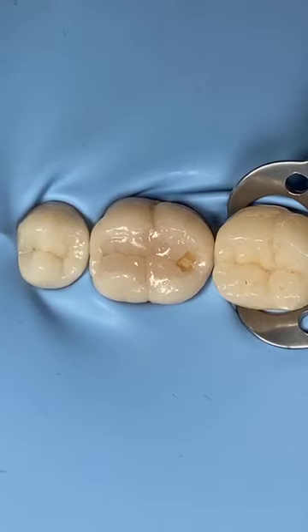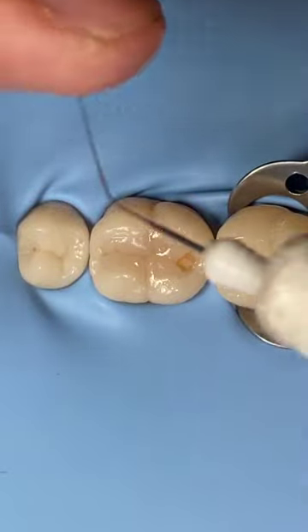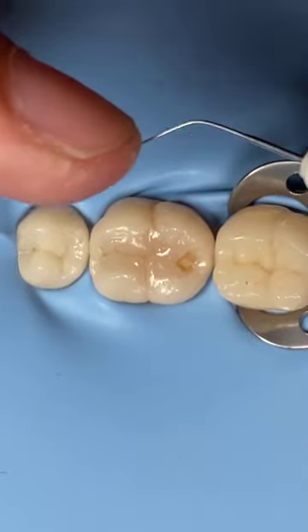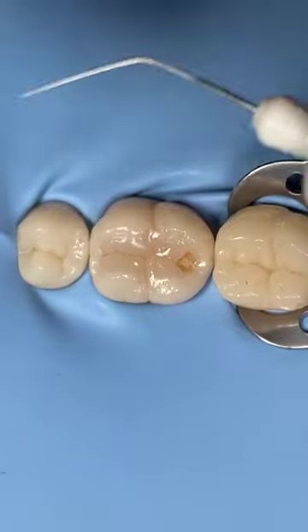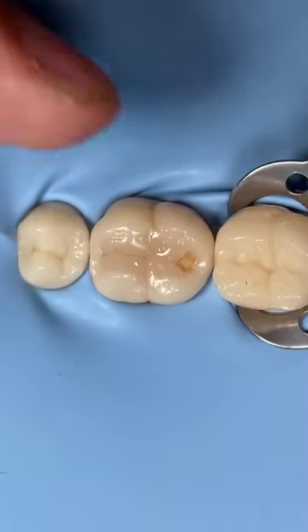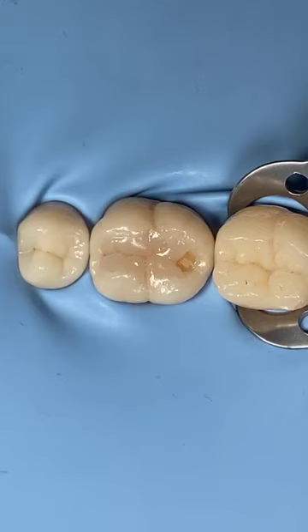The third step is carving. Take your magic instrument. I have a friend who is used to using the usual explorer to carve. It's okay, you know.